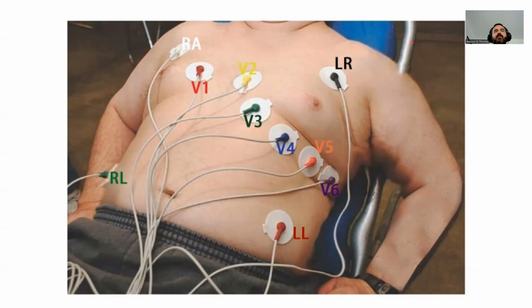So you do not need to memorize. And again, somebody in the comments can chide me and say that actually I'm doing y'all a disservice, but you're probably going to be okay unless you're working in specific settings. You don't need to really understand exactly which lead corresponds to which electrodes going where. In other words, like lead 1, I'm not even 100% sure myself off the top of my head, but you have the electrical signal going from here to here, or measuring from here to here, or here to here.